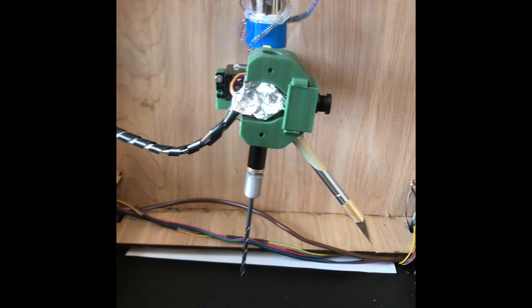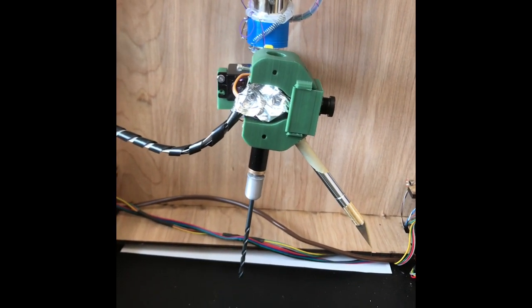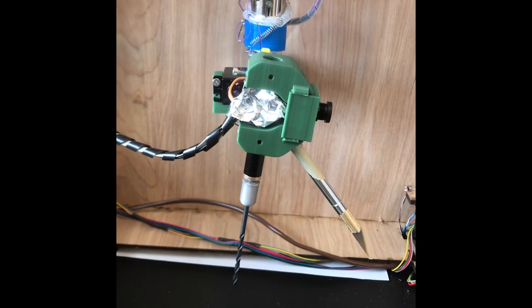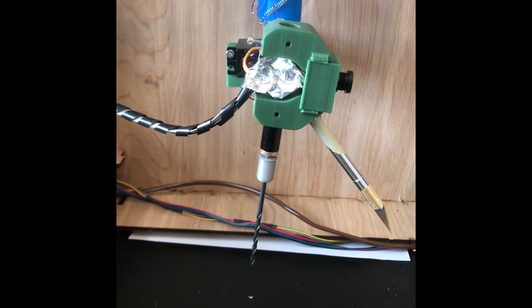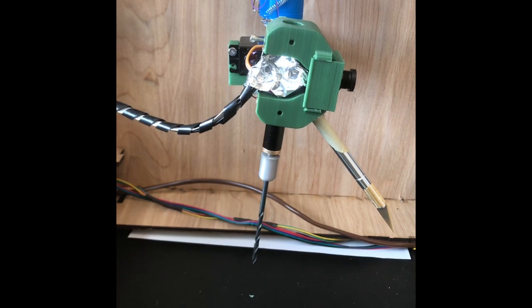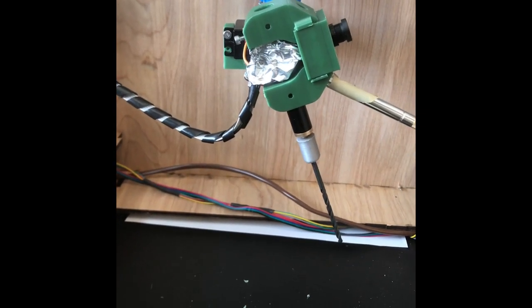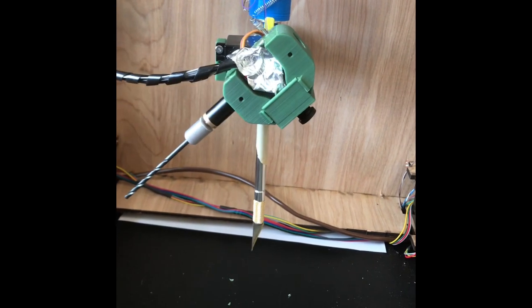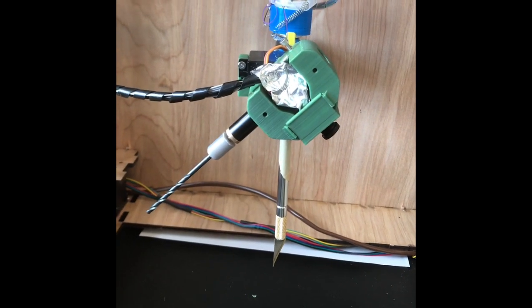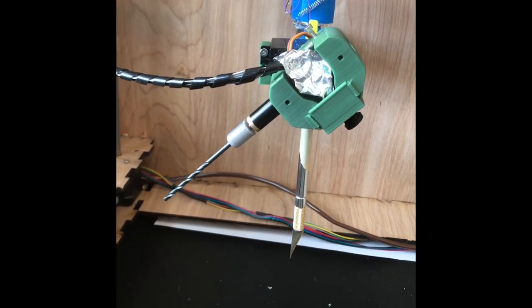Now in this, as described, the end effector has moved by about 90 degrees. It can actually have a rotational motion up to 180 degrees, but depending on our operation it has moved 90 degrees. Now this drilling action would go vertically downwards to drill into the skull and then relieve the pressure of the blood clot, and then once the operation is done, the drill stops, the end effector moves upwards, and then again it's rotated back to its initial position.